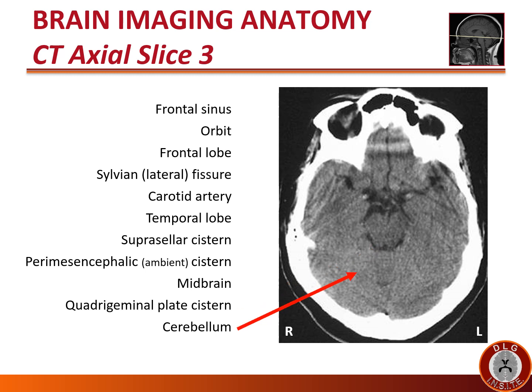The cerebellum lies posteriorly or dorsally to the brainstem still. Note there is still parenchyma centrally in the cerebellum — that's the clue that you're not yet up in the occipital area. The occipital area would have a fissure between the two sides, but the cerebellum does not. It has parenchyma in the middle called the vermis.